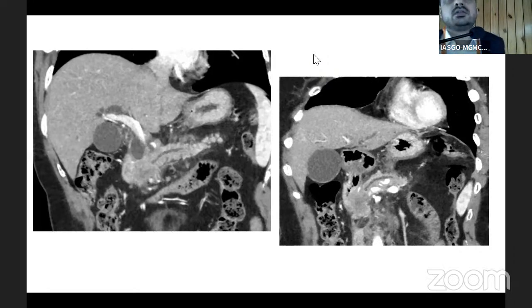We are already discussing. Yes. The point about the choledochal cyst. Yes, sir. Mildly dilated. For the various types of choledochal cyst as per the classification, it's usually not difficult. Difficulty comes with what we want to call them, right? It's mildly dilated CBD, those are the areas. But suppose we are unable to differentiate. The question now is, is it necessary to operate upon those mildly dilated CBDs? Previously, we used to think that every choledochal cyst has to be treated surgically, especially in younger patients because of the associated risk of malignancy.